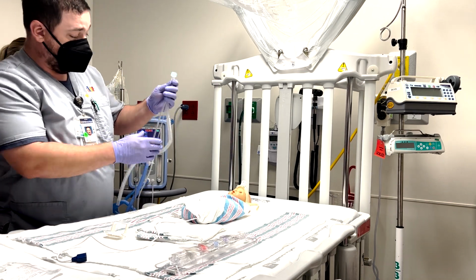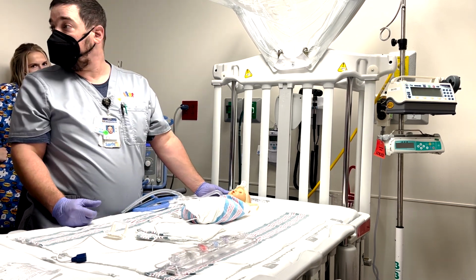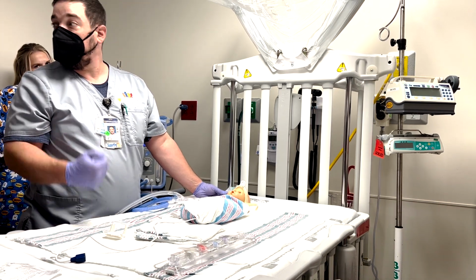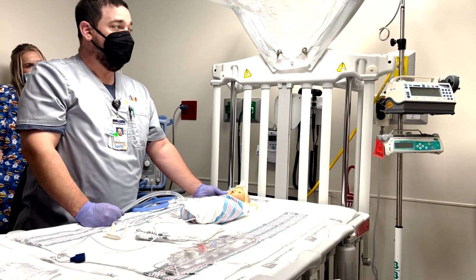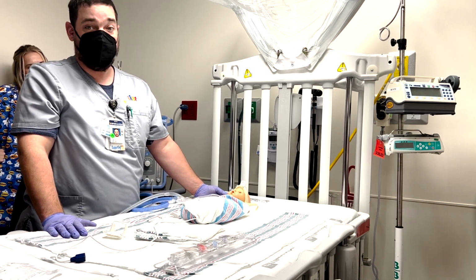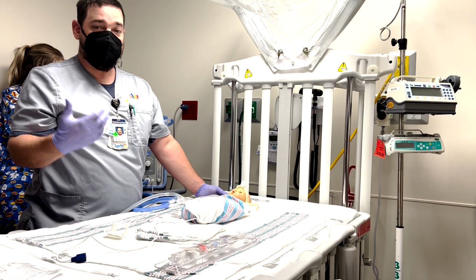Notice anytime there's a leak, that's what you're going to hear. This includes when the baby decides to be rebellious and open that gaping hole in their face that they were born with, that they eat and scream out of. That's the first thing they'll do, open up. We have chin straps to help with that. We're also going to definitely use calming techniques as best we can. Also, nothing by mouth. You've got that flow coming in, generating pressure, so you have a risk of aspiration.